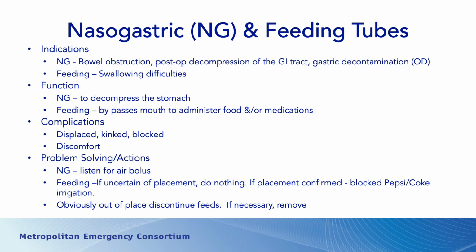So what complications might you see? Well, the tubes can be displaced or kinked or blocked. They can cause discomfort. The nasogastric tube is a bigger bore tube.